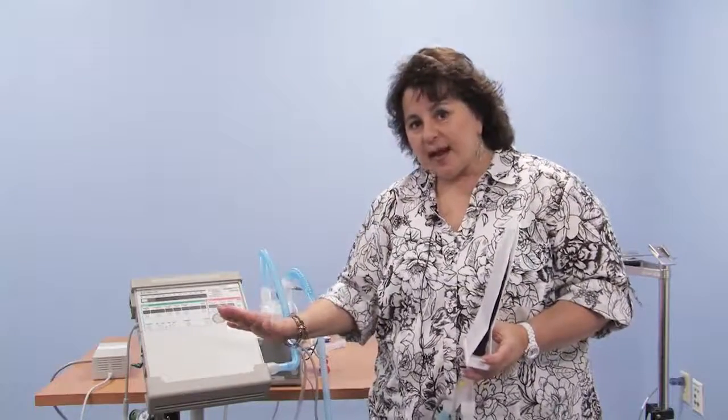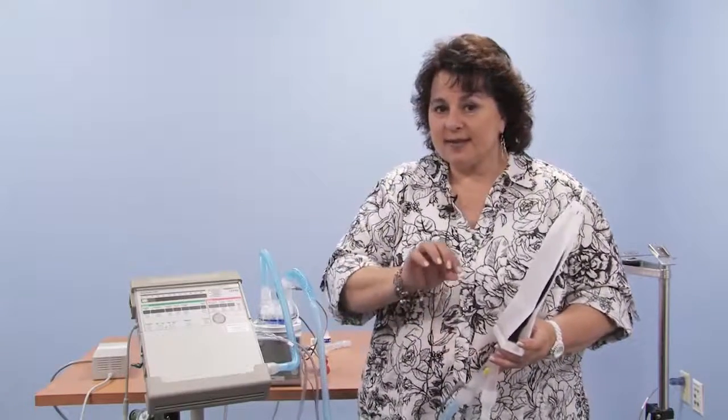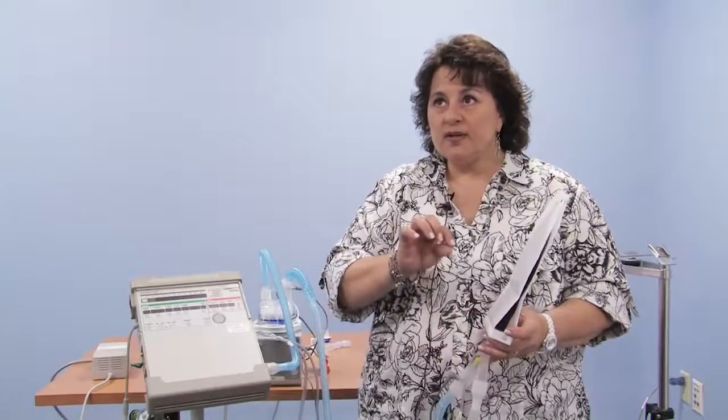In contrast to that, there's another mix of modes: mandatory breaths, either pressure control or volume control, and we call it pressure support. So some children receive what they call SIMV, which stands for synchronized intermittent mandatory ventilation. Your child might get 10 breaths of the volume or pressure type, and then in between those 10 breaths, if your child wants to get more air and take more breaths, we can also support those breaths with something called pressure support, otherwise known as BiPAP.